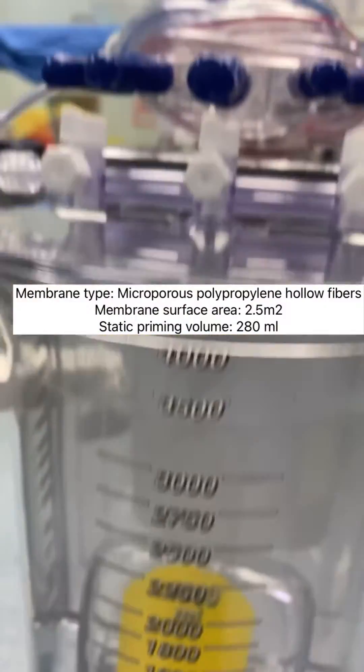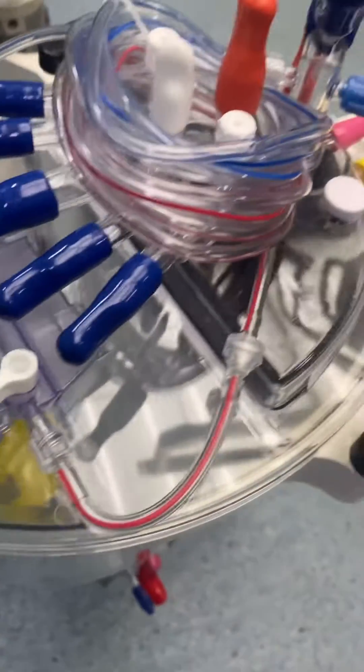Membrane type: microporous polypropylene hollow fibers. Membrane surface area: 2.5 square meters.